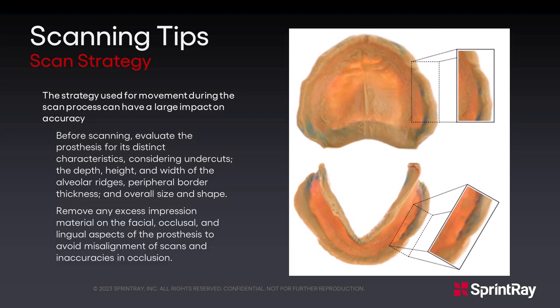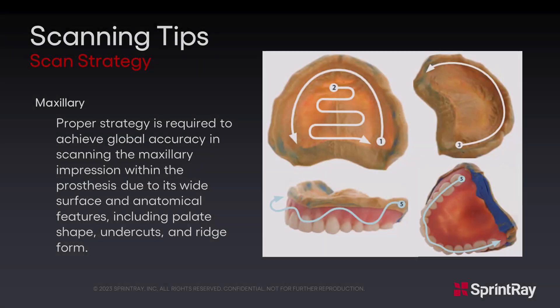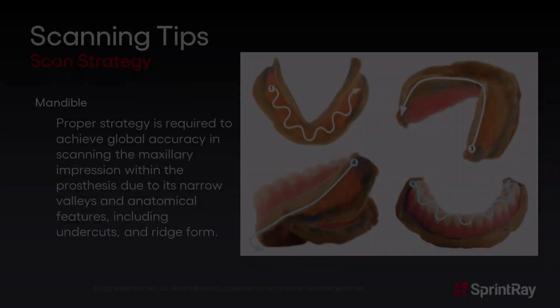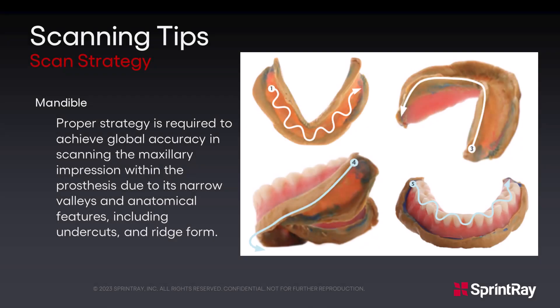The strategy used for movement during the scan process can have a large impact on accuracy. Please be aware of anatomical features and potential challenging areas before proceeding with the scanning steps. For the maxillary denture, follow the recommended scan strategy to ensure that the palate as well as the undercuts and ridge form are accurately captured. The lower denture will also have a particular scan strategy to ensure all data is captured from the undercuts and ridge form.